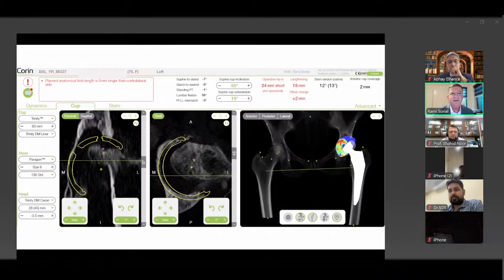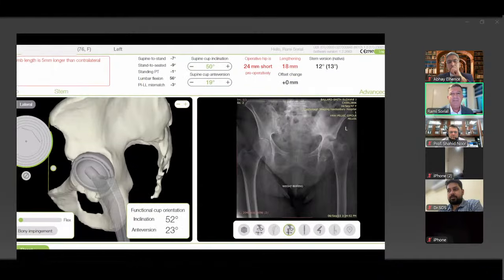I'm happy to sacrifice some of the medial wall in order to achieve anterior to superior contact. I can see from the heat map, I've got 60% host bone contact. I can bone graft the residual cavitary defects superiorly and get away with this. So this is what we aim to deliver.